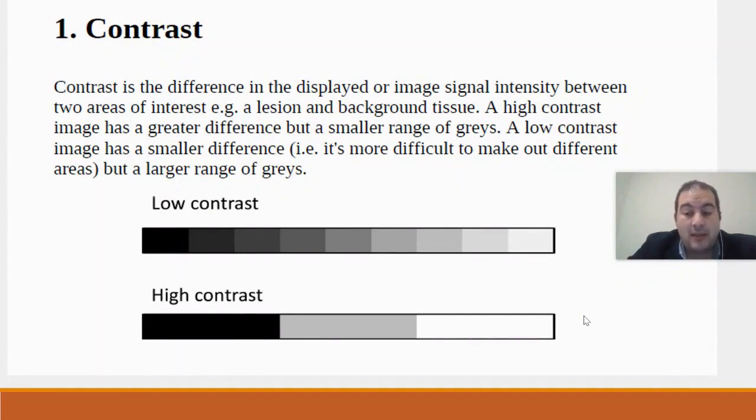You will also find that the type of imaging modality matters. For example, when I work with screen film radiography, can I achieve the same contrast as with digital radiography or computed radiography? You will find that screen film radiography is highly sensitive to the radiographic parameters, while computed radiography shows some differences.